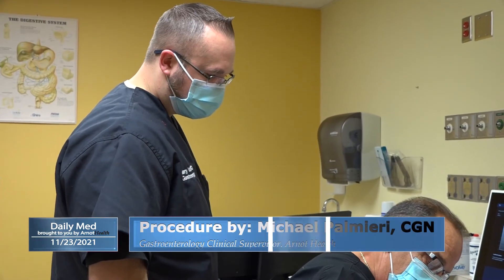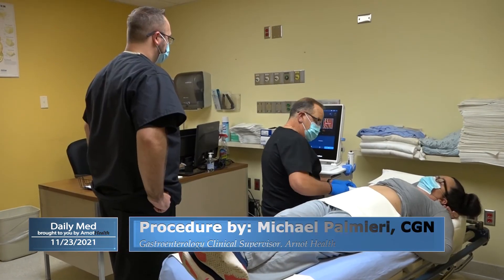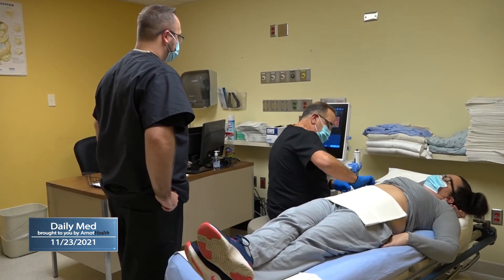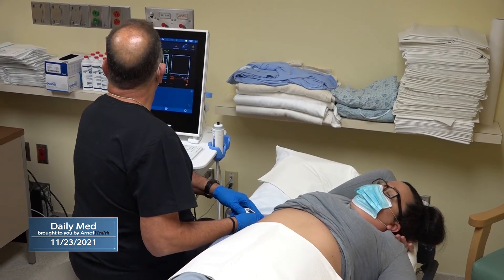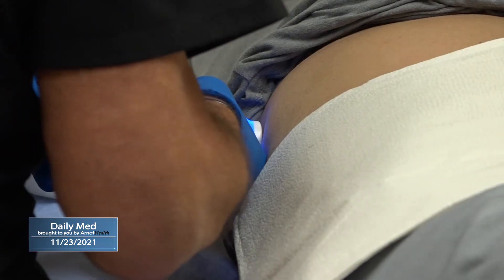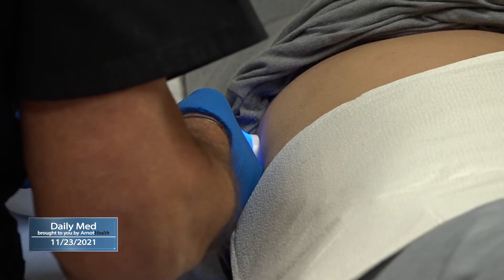Once you're in the examination room, we have you lay on a stretcher where we position your feet — your right foot crosses over the left foot. We have your right arm behind your head, and you make a little C shape with your body. Then we put the probe on the right side where the liver lies.